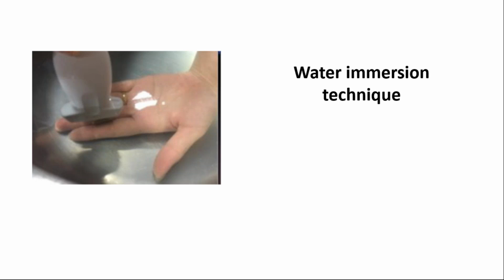Your focal point should be at the level where you want the maximum resolution. But when your structure is too superficial, it cannot move that far closer to the top of the screen. So adding a layer of gel or water or a standoff pad brings the focal point to the correct level.